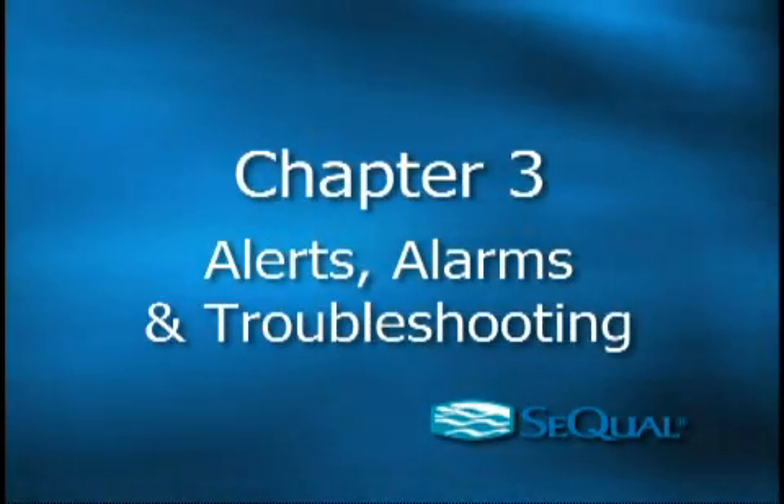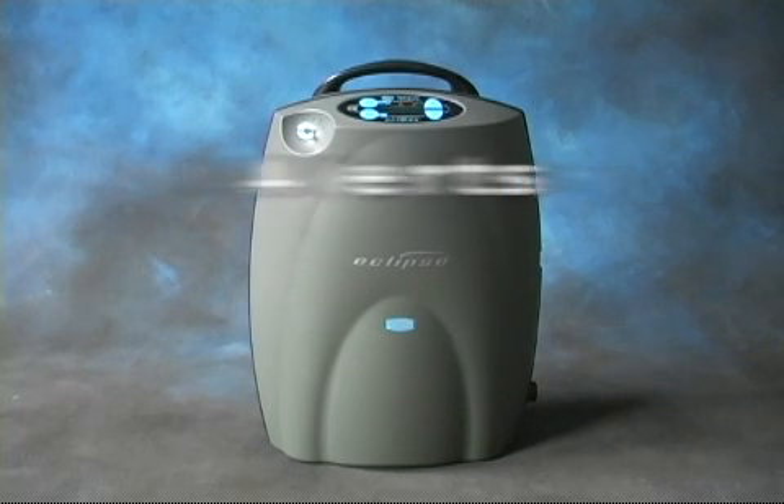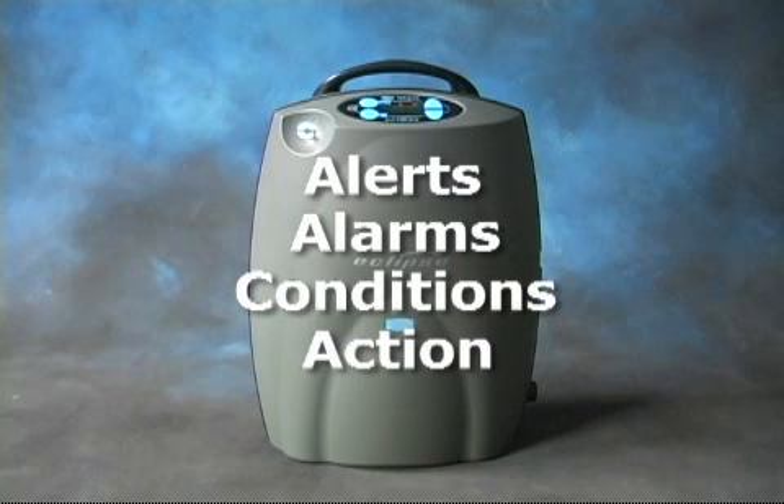Chapter 3: Alerts, Alarms, and Troubleshooting Tips. The Eclipse II is designed to notify you of any issues through a series of alerts and alarms. Your printed user's manual contains a complete list of these alerts and alarms, including what conditions they indicate and what action you should take.